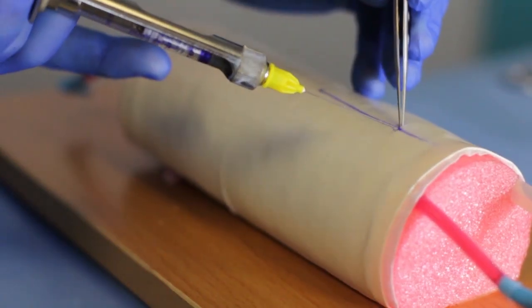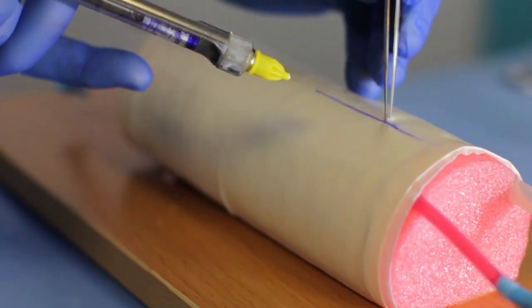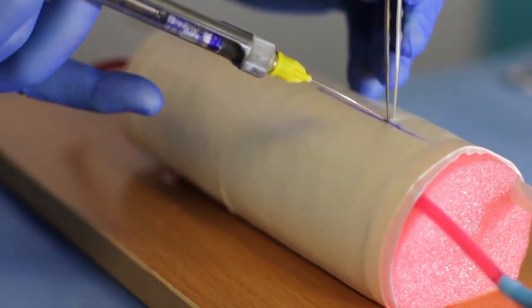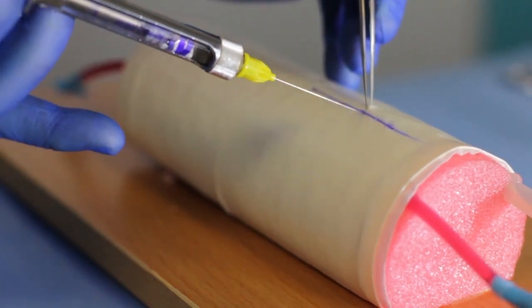Penetrate the laceration through the raw edge of the wound. Starting at one side of the laceration, advance the needle into the adjacent tissue for about one centimeter or three-eighths of an inch, at an angle of about 30 to 45 degrees.